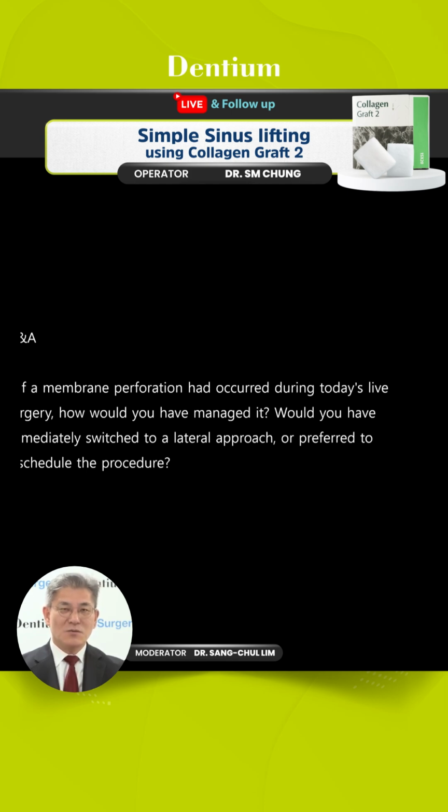However, with smaller bone volume, as I mentioned before, 2 millimeters, 3 millimeters, a challenging case, when trying the crestal approach, unfortunately we can get a big perforation. So it depends on the surgeon's skill, experience, and the anatomic situation. It means the position of the PSAA, the artery's course. With a lower artery course, actually, there may be a higher risk when you use a lateral approach.